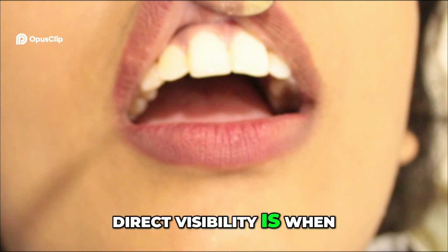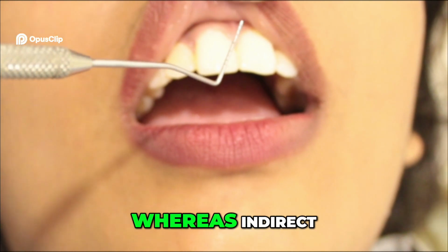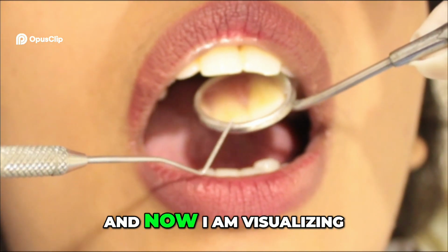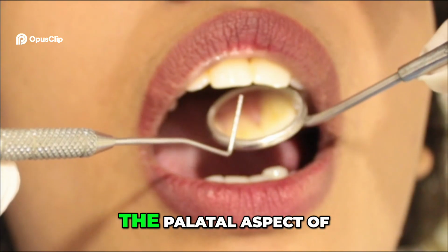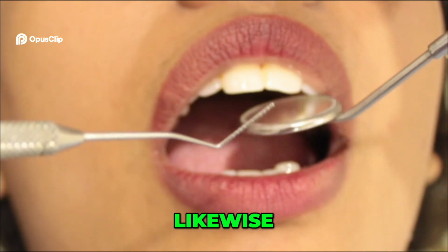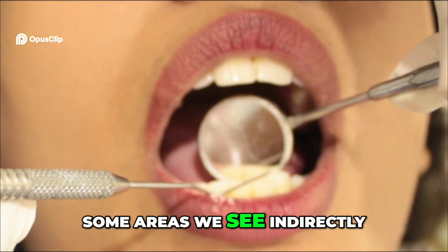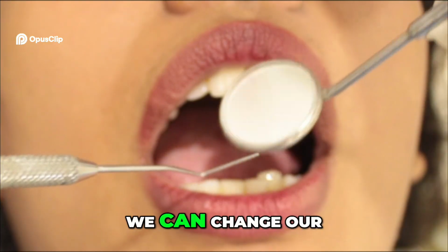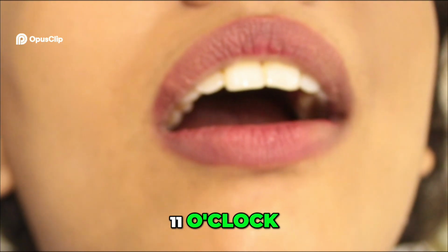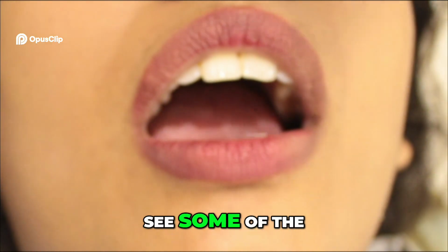Direct visibility is when we see the teeth directly. Whereas indirect, I'll use the mouth mirror and I'm visualizing the palatal aspect of upper anterior teeth. Likewise, certain areas I may have to see directly, some areas we see indirectly. We can change our chair position. It may be 7 o'clock, 11 o'clock, 1 o'clock, 12 o'clock, and accordingly see some of the teeth directly.